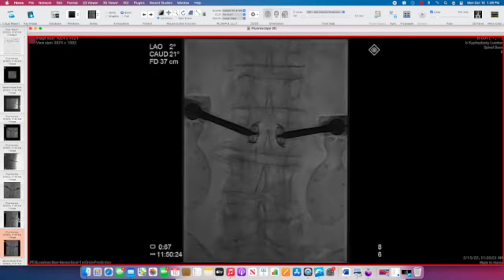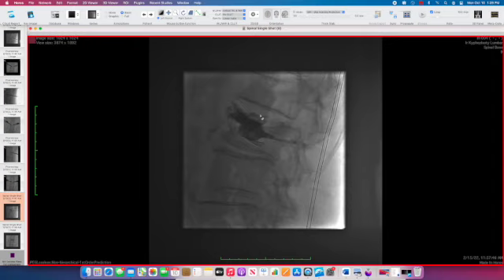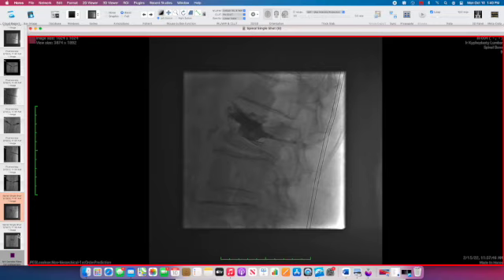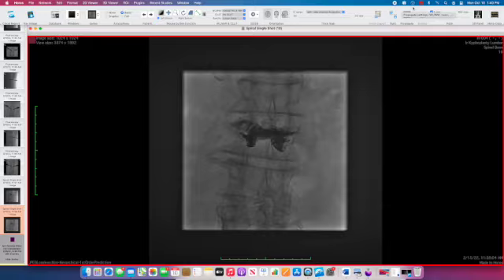In the AP view, you can see we've definitely elevated that superior end plate where the acute fracture was. We then instill cement — a little cement probably leaked out into the intervertebral disc space, which isn't the end of the world, and some cement went back along the cannula track, but because we were careful to go through the pedicle we know this is not getting into the spinal canal. We got really good infill so that the superior end plate fracture is bound up by the injected bone cement, and the patient had a really good outcome.